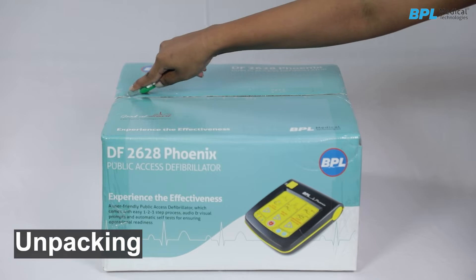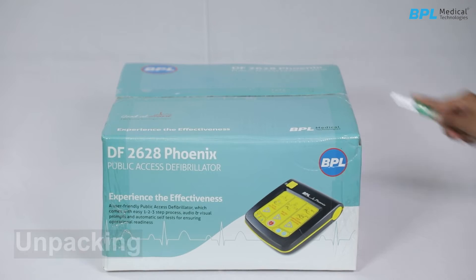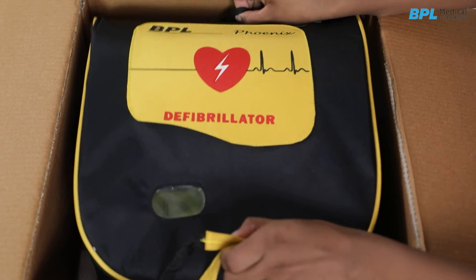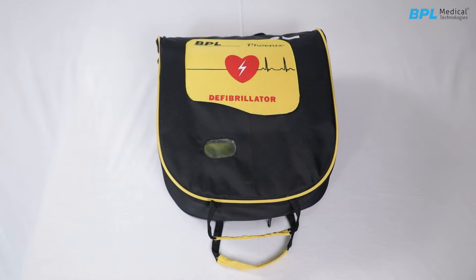Unpacking. Keep the carton box upright and remove the tape. The device is housed in a transparent pouch inside a carry case, and a handle is provided on the case to facilitate easy portability of the device.